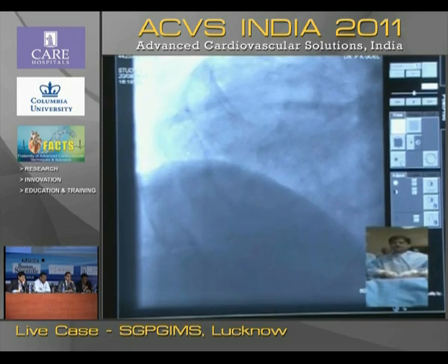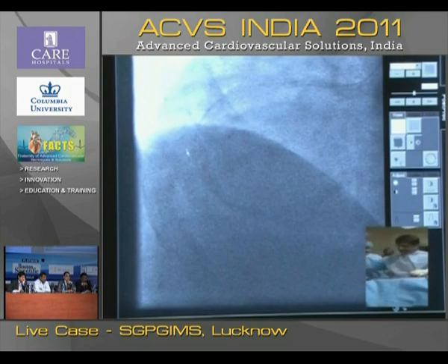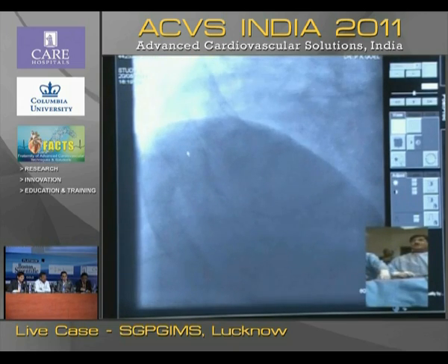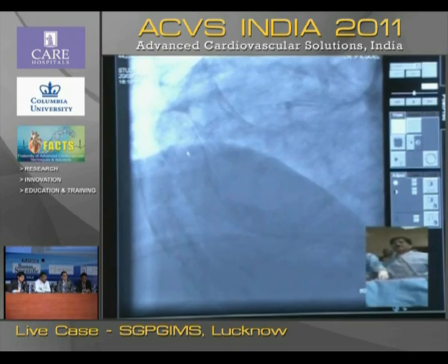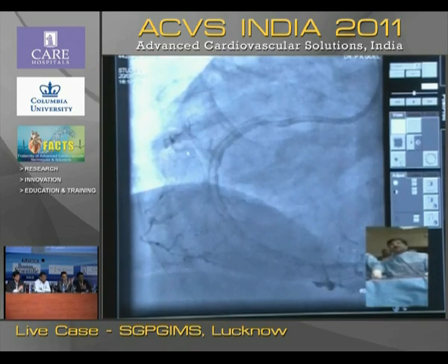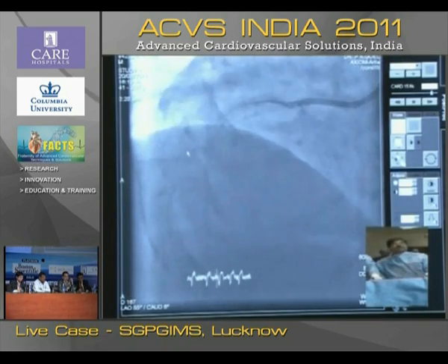The question is whether he has really covered the ostium. Let's see. Yeah, looks like covered. Test, come on, inject. I think it's all good. That's a great job done. Good. Great job. Are you okay with the result? Dr. Goyal, all appreciation for you.